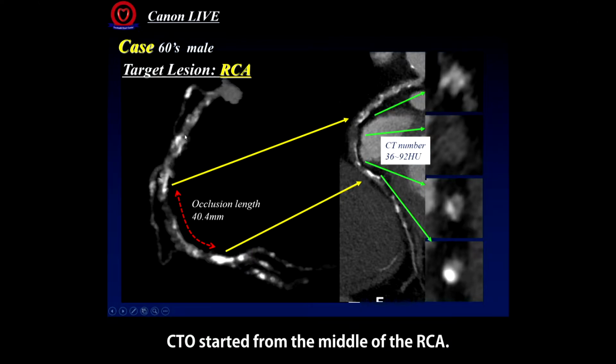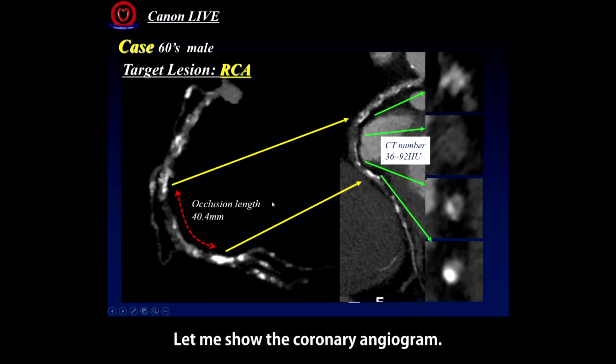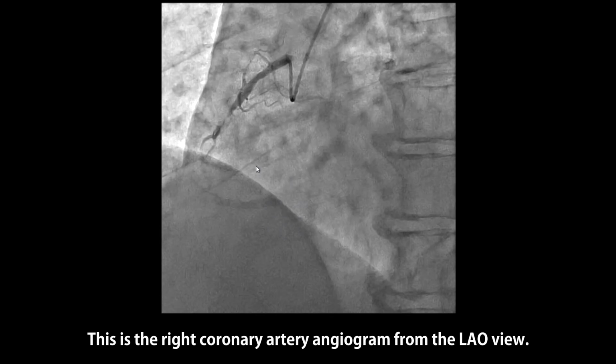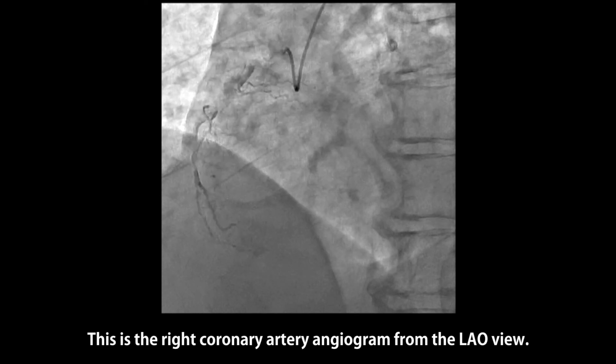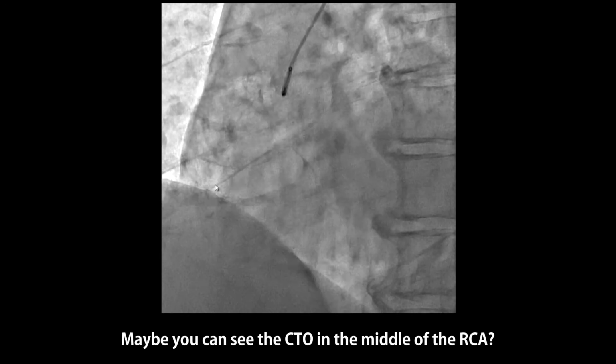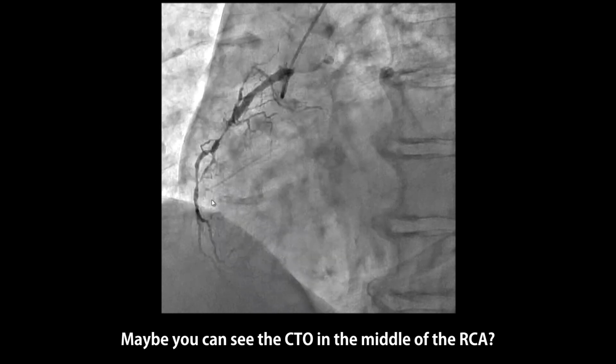And the CTO started from the middle of the RCA. The multi-slice CT findings estimated the occlusion length at 4 centimeters. Let me show the coronary angiogram. This is a right coronary artery angiogram from the LAO view. Maybe you can see the CTO in the middle of the RCA.